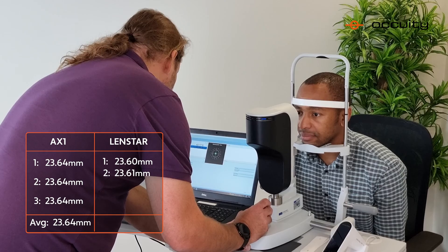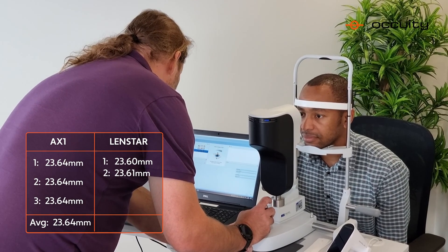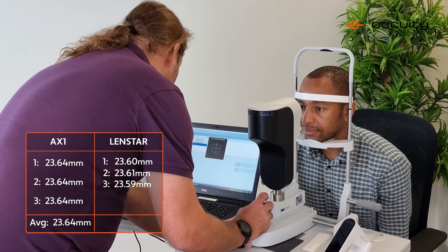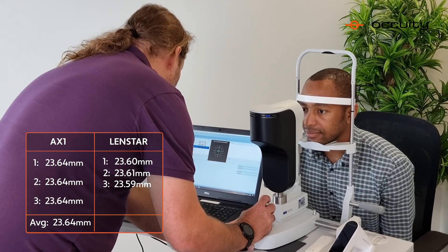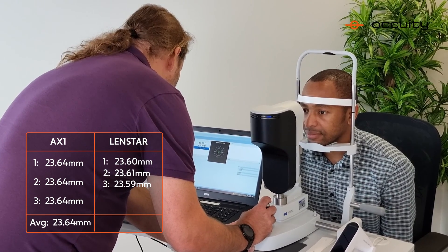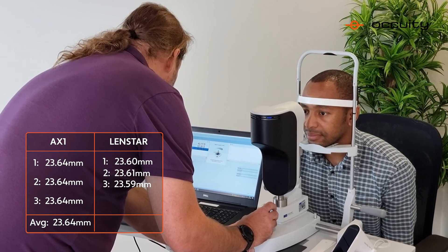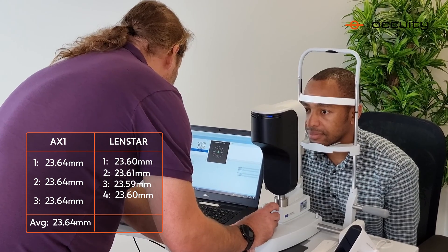Third measurement, 23.59mm. Keep focus on the red dot and hold still for me. Fourth measurement, 23.6mm. And the last one.